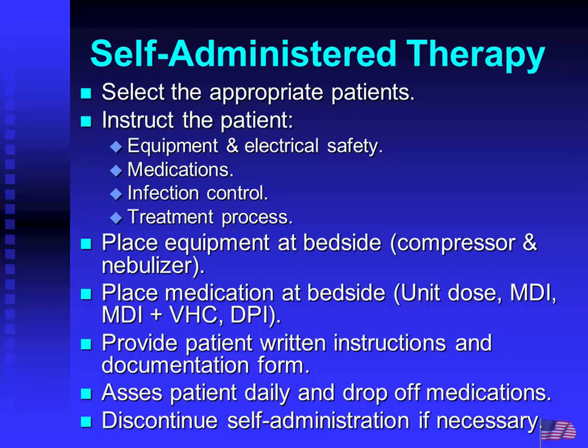This is where we would use a small compressor to deliver the medications. They would have their medication at bedside or at the nursing station, and the nurse would dispense it to the patient. Written instructions, and then daily we would go in and drop off more medications, but also do a primary assessment of the patient, and when it's necessary, they could be discontinued if the patient's obviously discharged or something along that line.